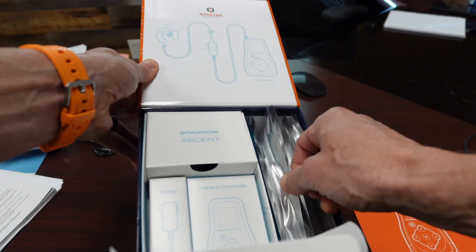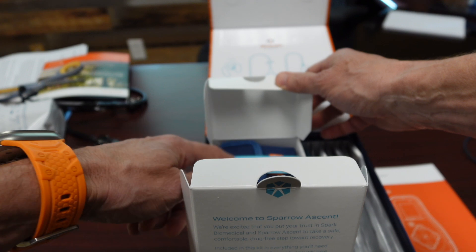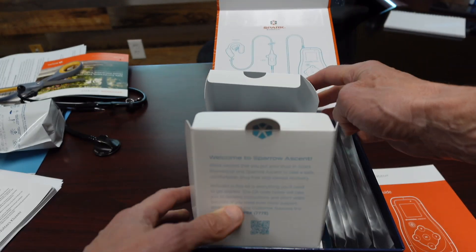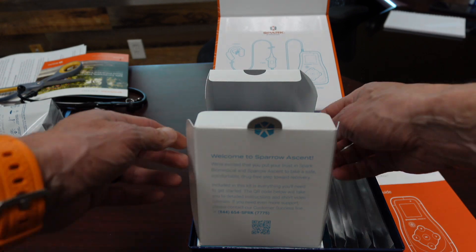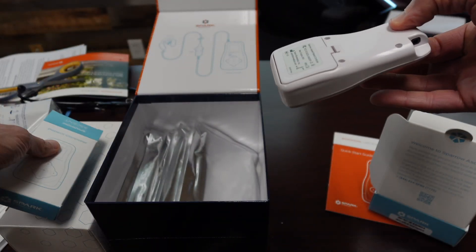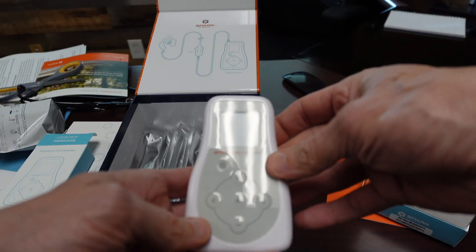This is the main box that comes with the controller, the cable, and the earpiece — three pieces. Most of the earpieces, or all of the earpieces, are left-sided earpieces. You can't get right-sided ones; that has to be ordered separately for some reason. And if you do need earpieces, they're pretty expensive, surprisingly.